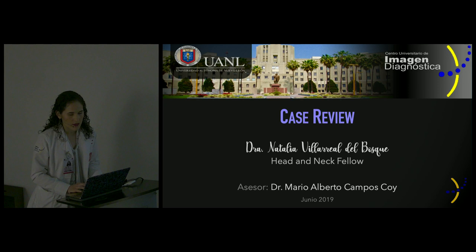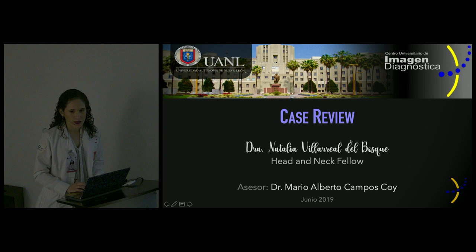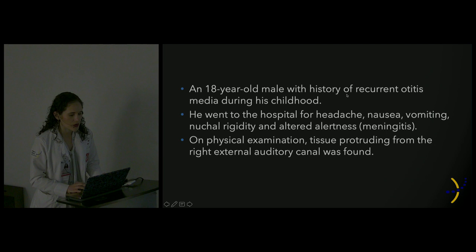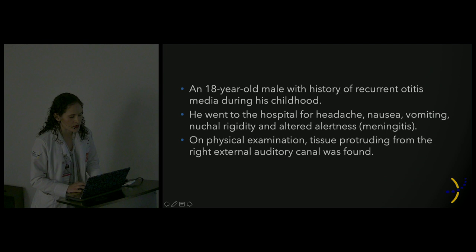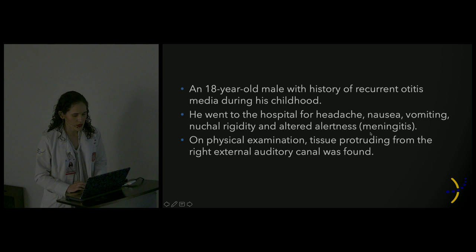I'm going to talk to you about my case review. I'm a head and neck imaging fellow; the director of the head and neck program is Dr. Mario Alberto Camposcoy. I'm going to talk to you about an 18-year-old male with a history of recurrent otitis media during his childhood. He went to the hospital for headache, nausea, vomiting, nuchal rigidity, and altered alertness, so the diagnosis of meningitis was made. On physical examination, tissue protruding from the right external auditory canal was found, so the medical staff requested a CT of the patient.